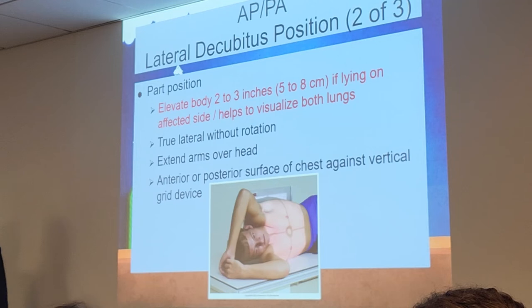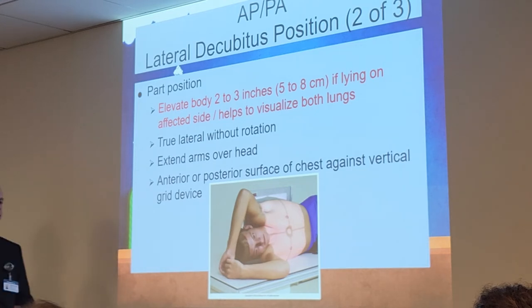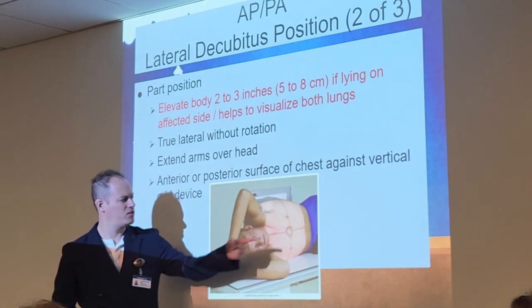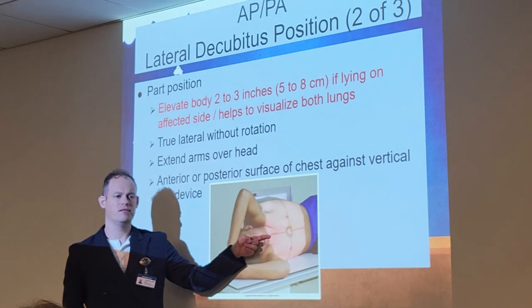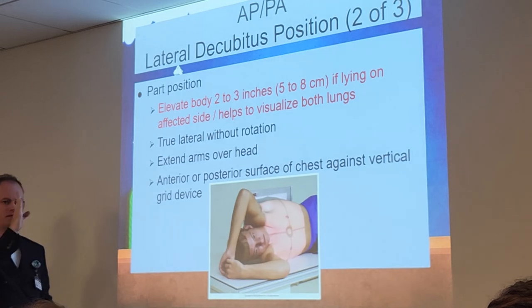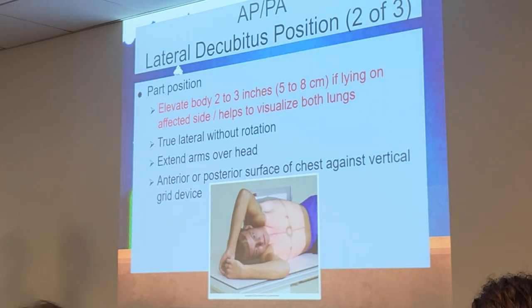Yes? That line that goes to the imaginary nipple line, mm-hmm. That's MCP, right? Correct. But isn't coronal like this way? Where are you asking again? I'm sorry. You're centered right on the. No, this one. That's MSP, right? Yes. MSP, MCP. Okay. And that's the imaginary nipple line? Or it could be. That's a way you can use. Well, don't worry about the nipple line. That's more so for centering your crosshair. That's not really going to relate to your MCP versus MSP. Don't let that mess you up.